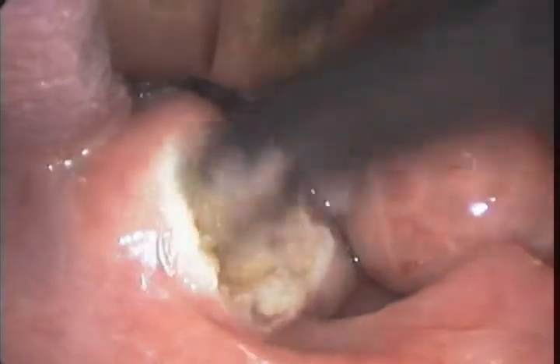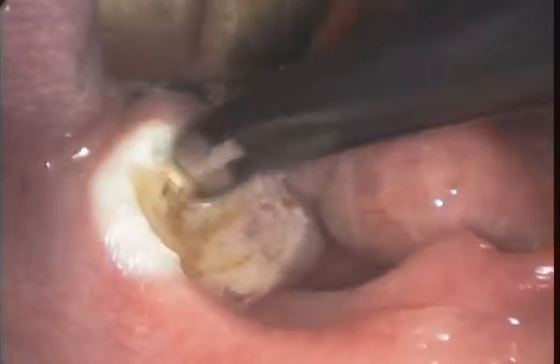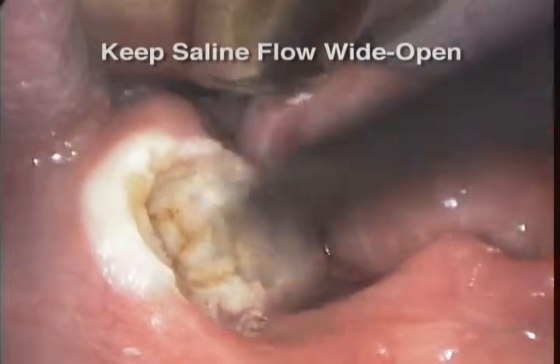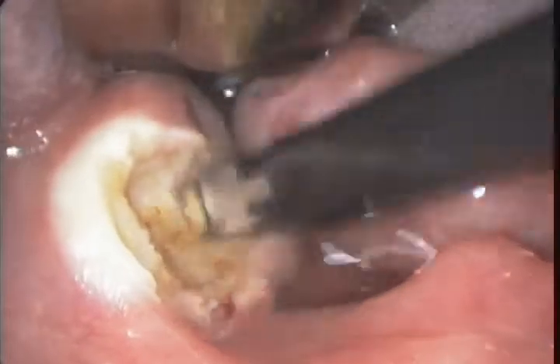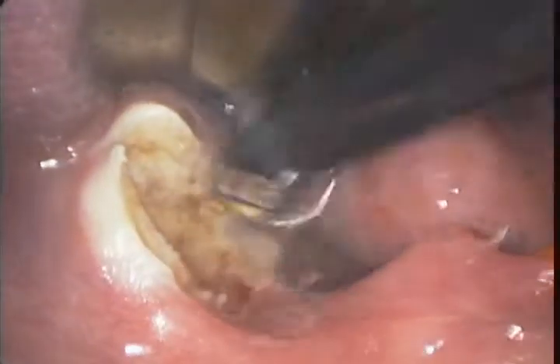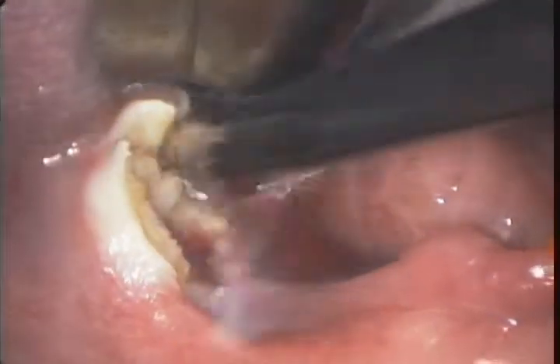and what you're trying to achieve is a saline interface between the tip of the wand and the tissues. All of the plasma ablation occurs within the saline interface. Now, as long as you maintain an effective saline interface, you won't get any clogging of the device. And if you experience any clogging of the device, it just means that you're not providing an optimal saline interface. The position where you start from doesn't matter as much, although the way that I usually do this is I usually just start from the surface of the tonsil and I go inwards.